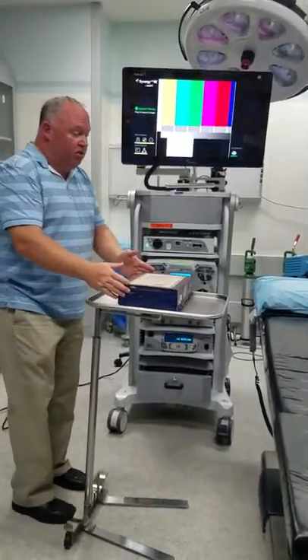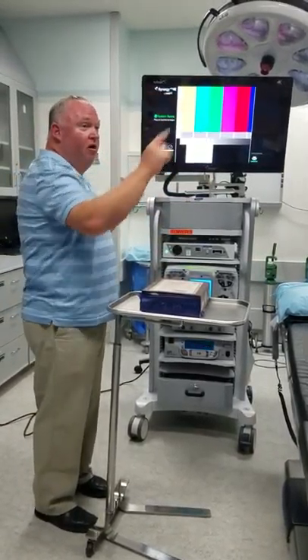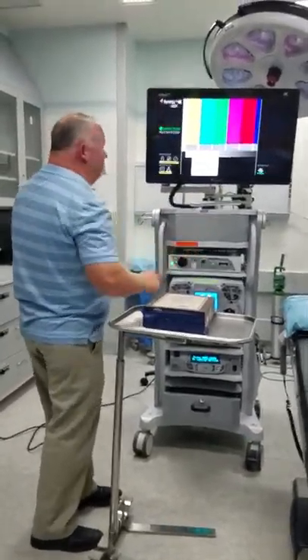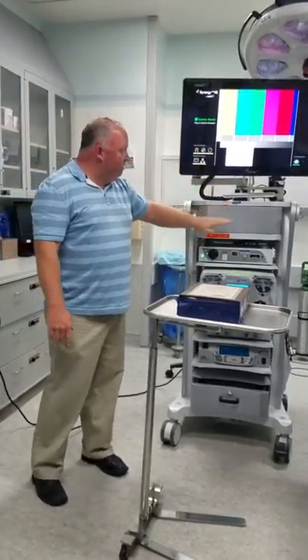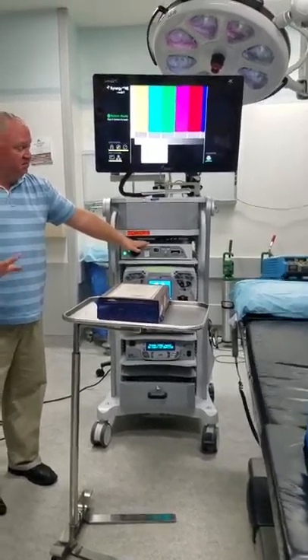Sometimes this is the patient, doctor's there, I'm here, he's looking at a screen here, I'm looking at a screen there. I can't do this when I'm trying to scope, right? So it's the same picture, which is two screens, right? But this is a single screen scope tower. A lot of things are on here. This has got a camera and a light source all in one. A lot of times it's two separate things. Does it make a difference, really?